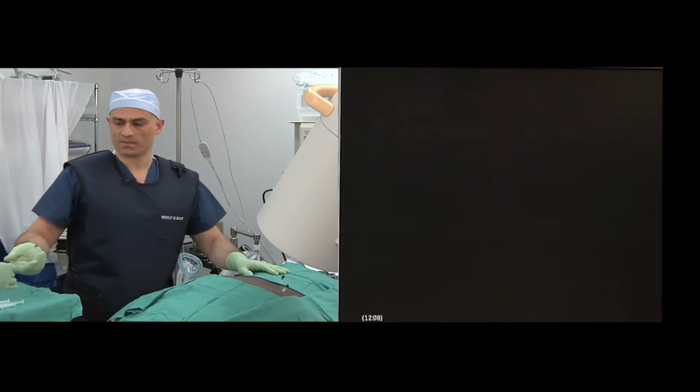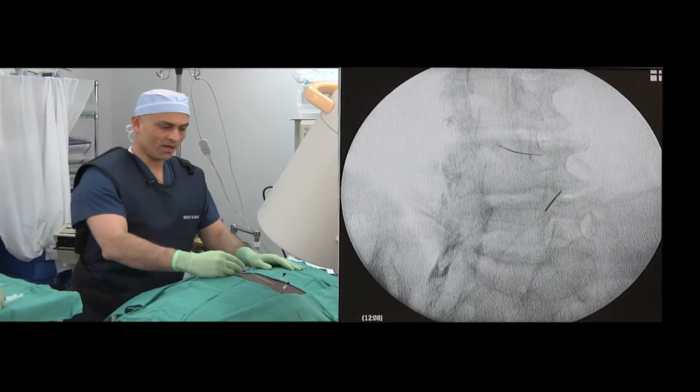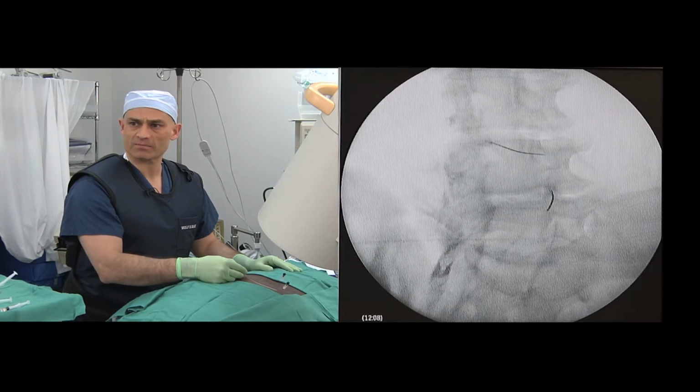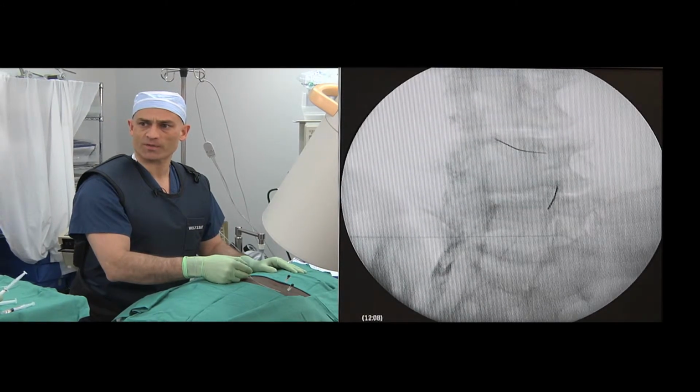Into the joint space. The L5-S1 facet joint is then addressed in a similar fashion using fluoroscopic guidance.